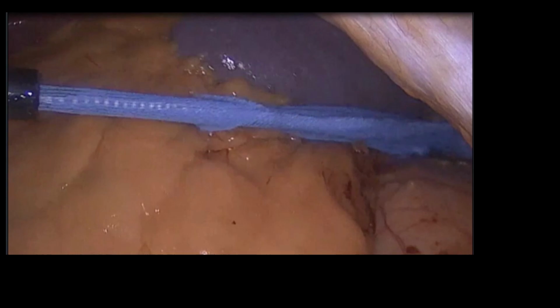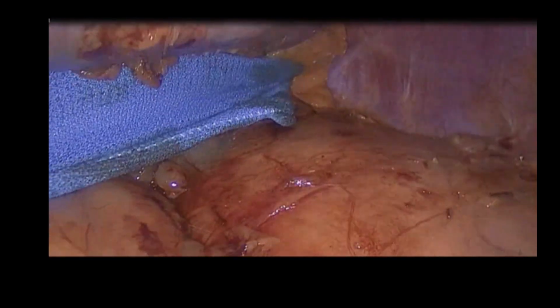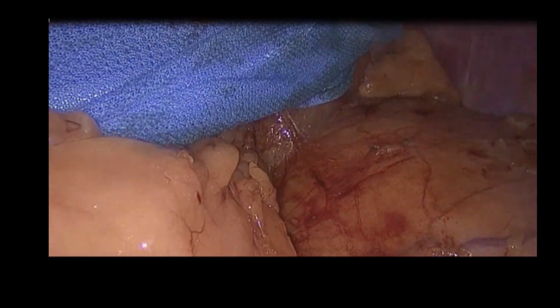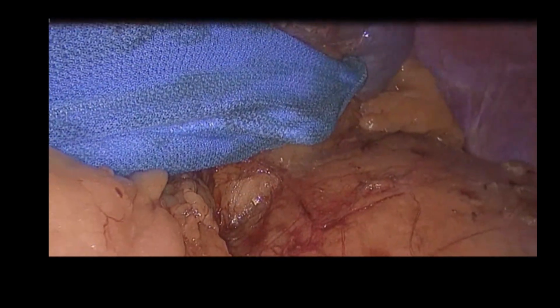This is on the left side. Notice I'm bringing in the paddle retractor as small as possible, which helps me get on the lateral aspect of the spleen. You'll notice I then open the paddle retractor up a bit and roll posteriorly to get into a position where I want to provide more exposure to a particular area of the retroperitoneum, and then I'll open the retractor up more as needed. And you can open and close as needed to work your way around whatever you're doing.